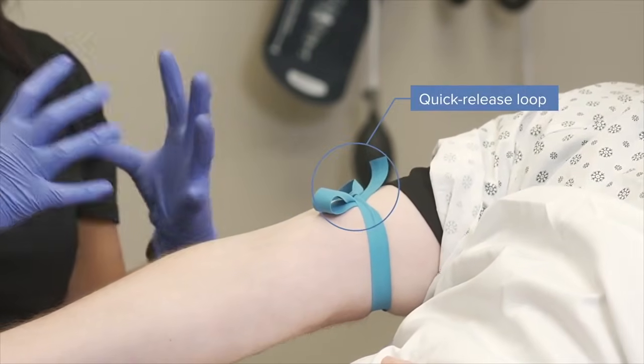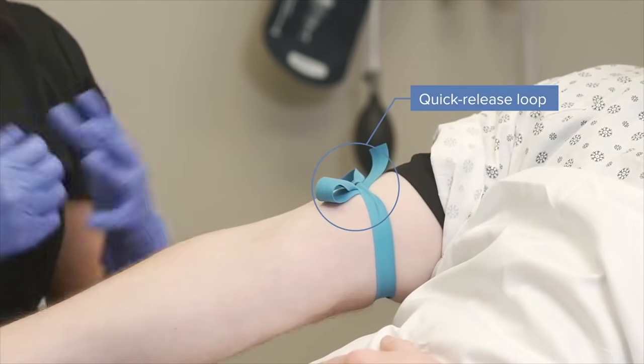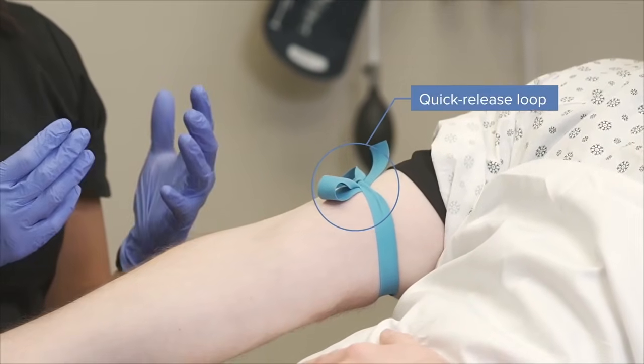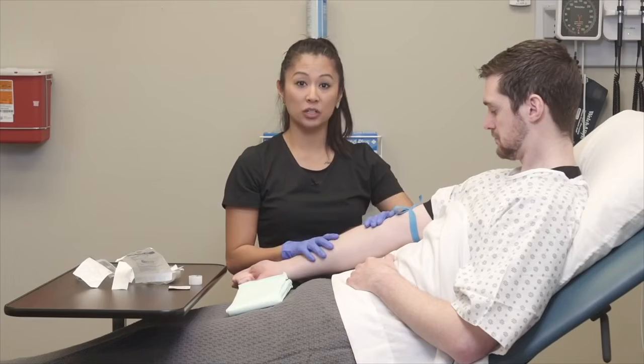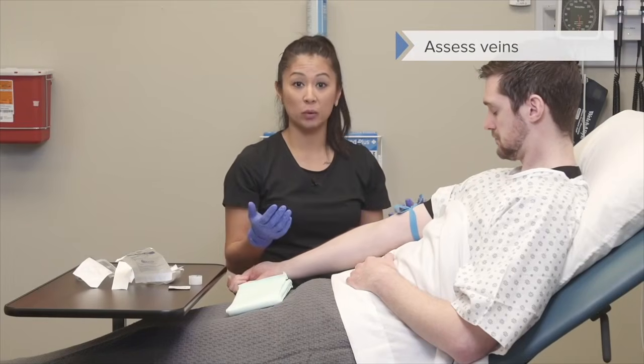So this should be nice and tight on the arm. So know the longer we keep this on, this can definitely impede circulation, so keep that in mind. So now that this is on our patient's arm, now we get to assess the veins and see which insertion site we want to go.